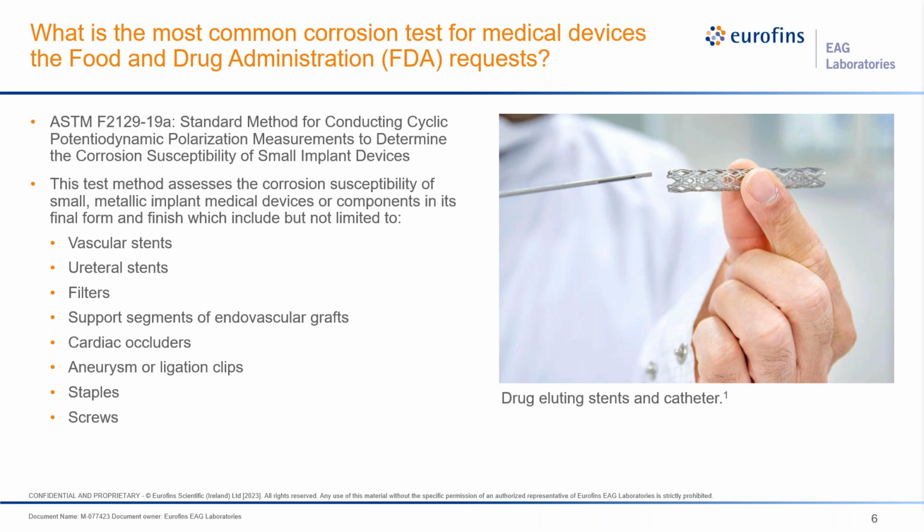Testing should be performed in the final form in which it enters the body, after subjecting the medical device to simulated assembly and implementation, which includes compression, loading, and deployment of the medical device through an in vitro fixture that mimics in vivo anatomic conditions. Alternatively, comparable stresses and strains expected in vivo can be simulated.